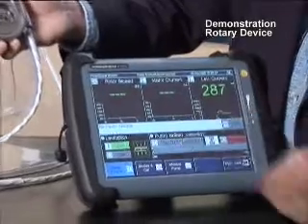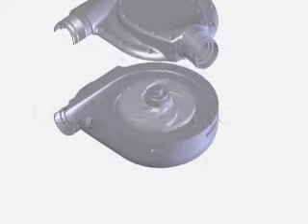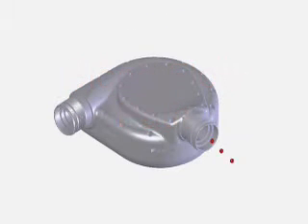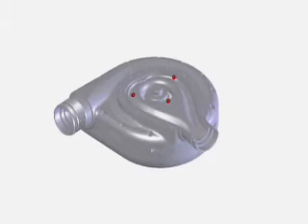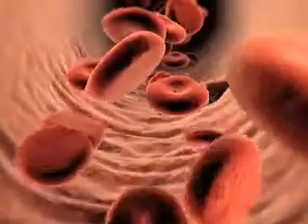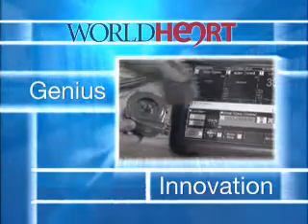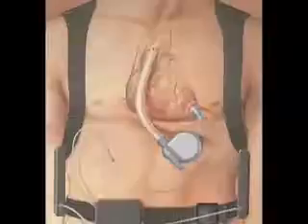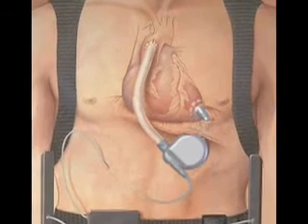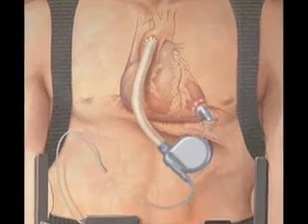Our 4th generation device eliminates mechanical wear by magnetically levitating the floating impeller. It's wonderful to see this suspension because you know that it gives you the kind of gaps and clearances that allow the blood to flow through it, being very gentle to the blood. Magnetic levitation can work and has been made to work, but our challenge was to simplify it so much that it could then be used inside a person.